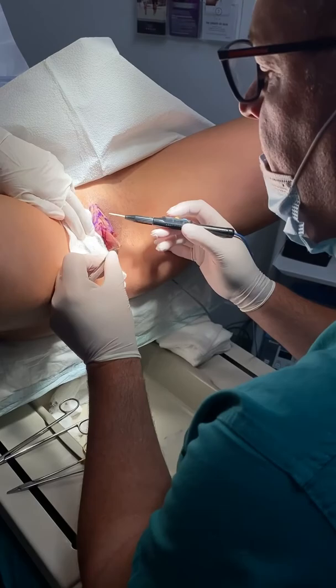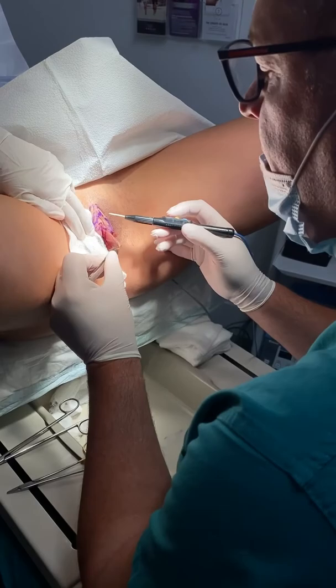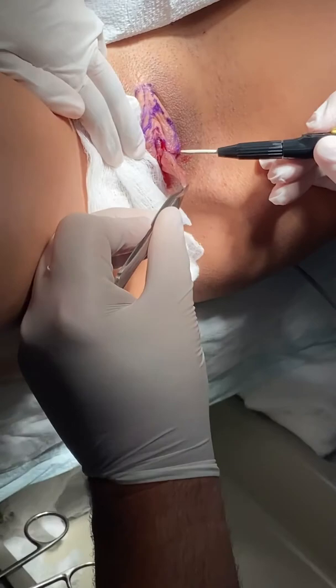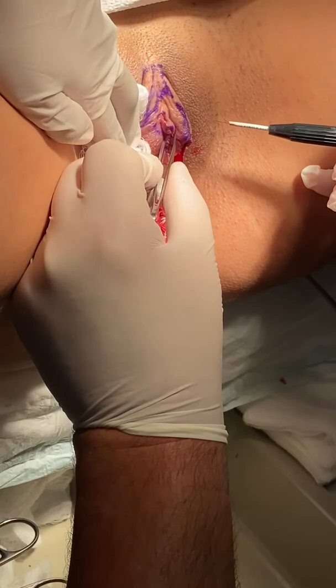I'm going to do the same thing to the other side. So we're using my Ellman Surgitron — you can see the needle tip, how fine it is. I'm just gently dissecting and following the lines that we already drew, and I'm just going to slowly remove this labia. Then we're going to reconstruct it by re-suturing it together. She's doing amazing.